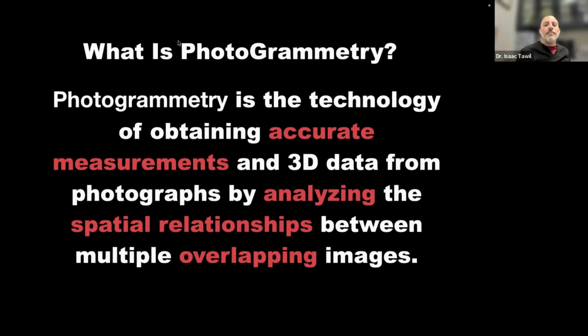There we go. That has these known measurements. It collects the 3D data by analyzing those spatial relationships, and it's using the overlapping images. So it is stitching, but stitching very differently. It's stitching using mathematical algorithms, and it's only taking pictures of known objects. So it's taking, let's say, a marker that I put in an area and another marker, and it's measuring the distances between the two. So it's not just capturing them, but it's capturing them by mathematical data positioning.